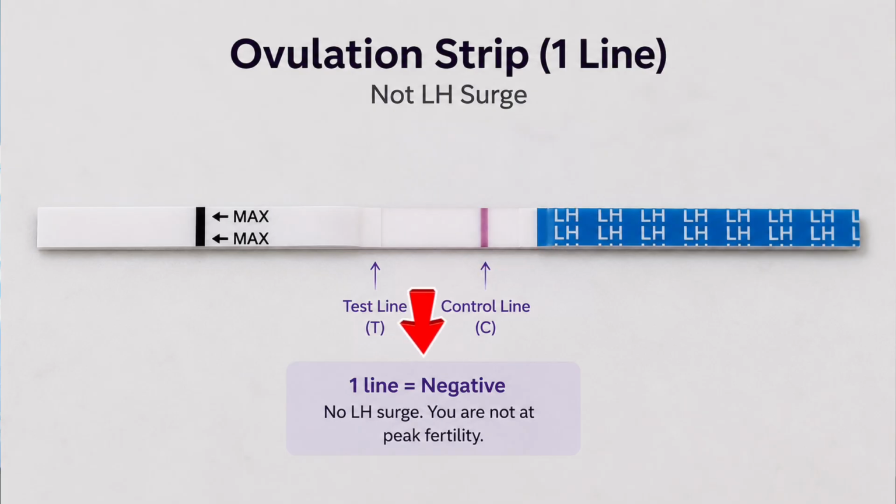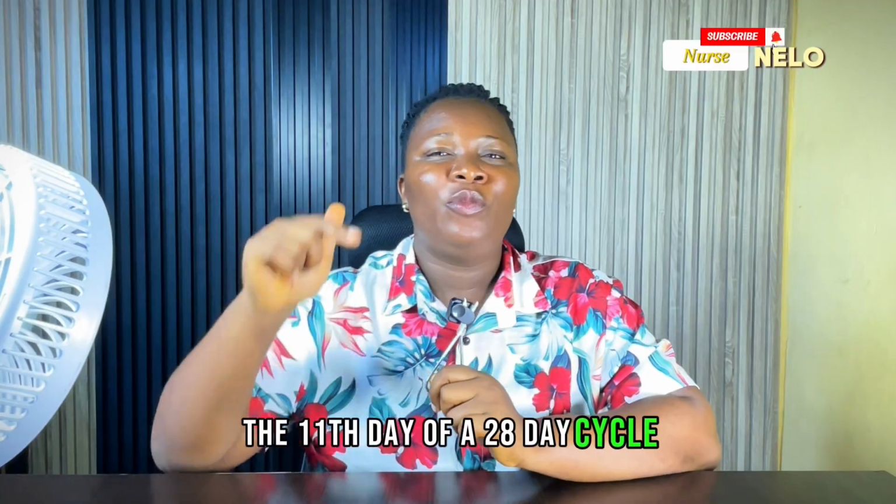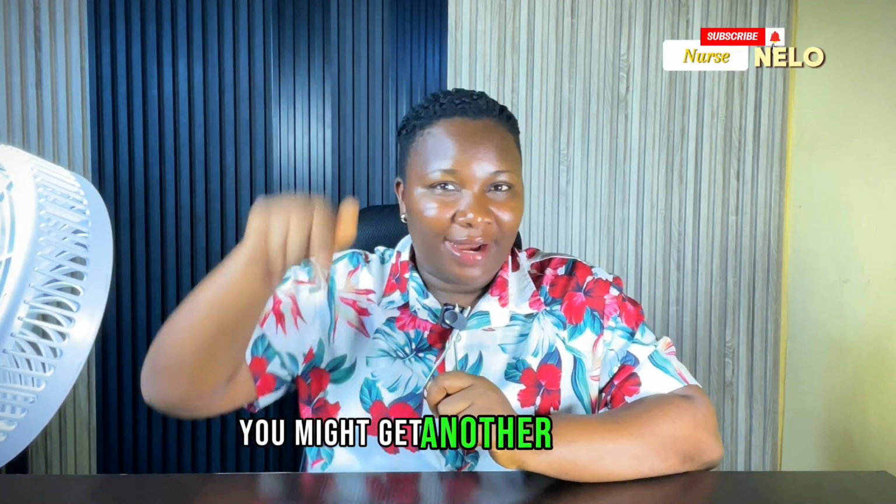Just get one line. That's what you will get. One red line. You will keep it. I always tell my clients, keep it. Then the next day, which is the 11th day for a 28-day cycle, you test again by noon. You might get another red line.